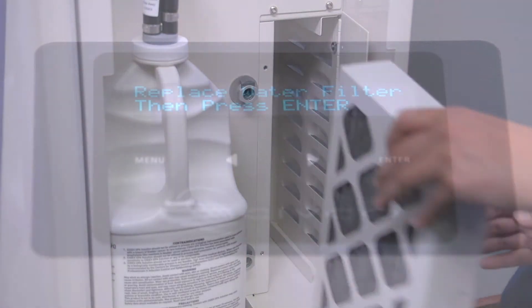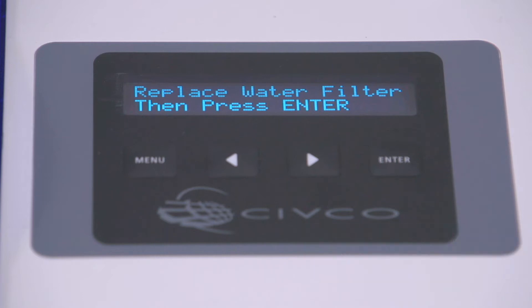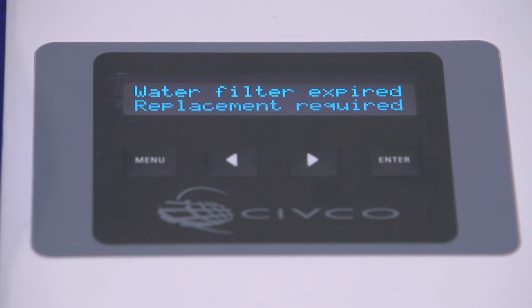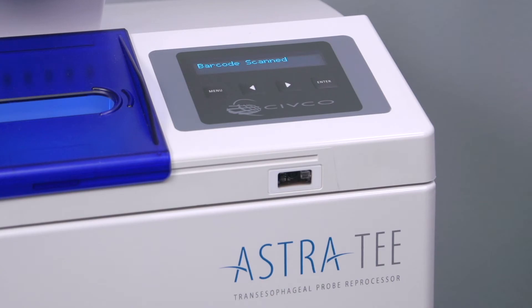If your filter becomes clogged or you've reached six months, the display will show 'Replace Water Filter — Press Enter.' If you do not change the water filter within three days after the warning, the screen will alternate between 'Water Filter Expired — Press Enter' and 'Water Filter Expired — Replacement Required.'